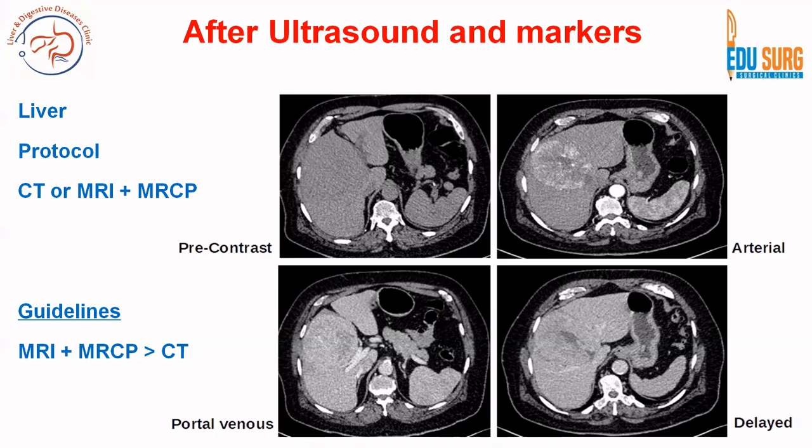We have separate videos on liver protocol CT and MRI, as well as pancreas protocol in the radiology playlist. In a liver protocol — CT or MRI — you will have pre-contrast images, arterial images, portal venous, and delayed images. Note that the images currently shown are diagnostic of HCC, not intrahepatic cholangiocarcinoma — they are included as a reference to the liver protocol video.